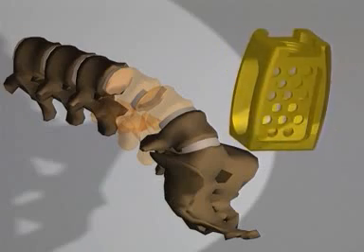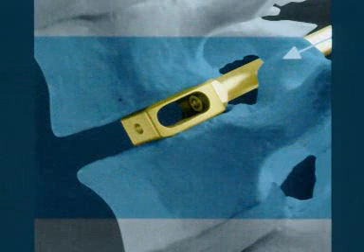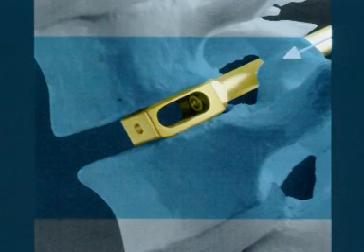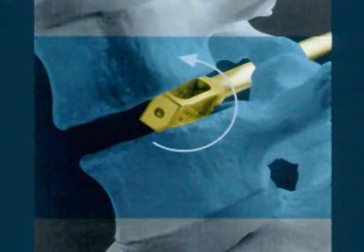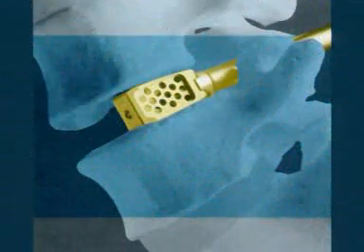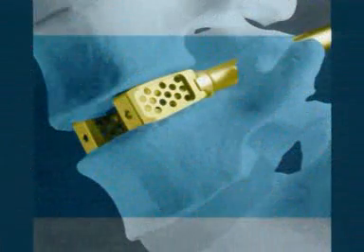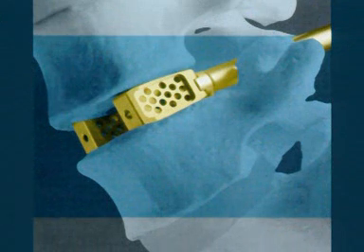The Contact Fusion Cage system is used. It consists of two implants sitting side by side in the former disc space. A cage fixed on the inserter will be introduced in a minimum height position in the intervertebral space, then rotated 90 degrees to its maximum height to spread the intervertebral space. The second cage is implanted beside the first using the same procedure. The contact surfaces of the cages are designed for acceptable contact pressure on the intact vertebral cortical end plate.